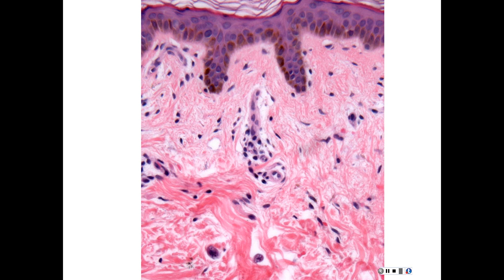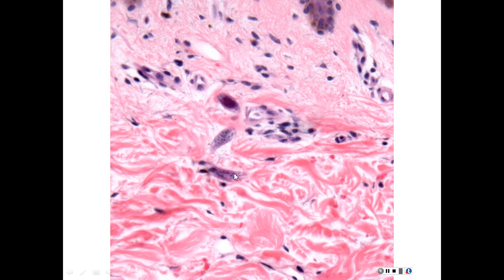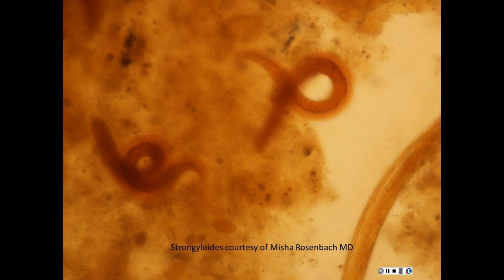Southerners have worms because the climate is milder. And there was one study at Duke Medical Center where it was the most common disease among immunosuppressed cancer patients. It was strongyloides, which they walked around with, well compensated, but then potentially fatal. You're seeing in there? Yeah, see the little stippled interior here that suggests that you have microfilariae. And that is from Misha. This has been widely published.